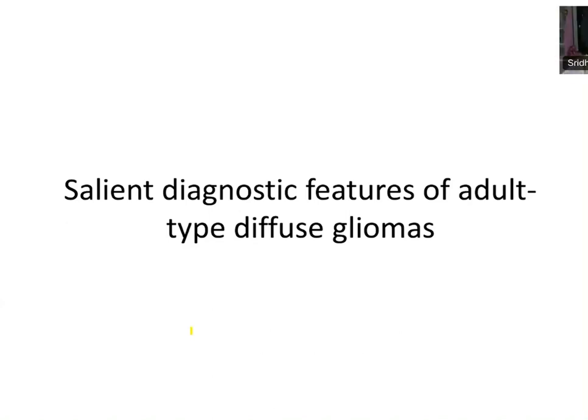Any other questions? Yes, sir. If it is an astrocytic tumor on HE with mild pleomorphism, just like this case, and no microvascular proliferation or necrosis, but IDH comes negative, no mutation, what should we sign it out as? That we'll address at the end of the other two cases.